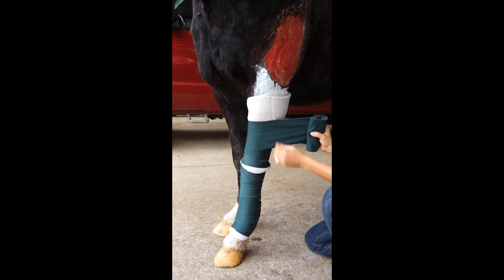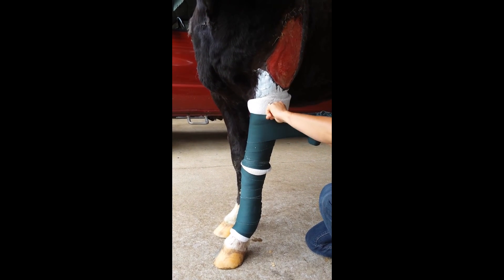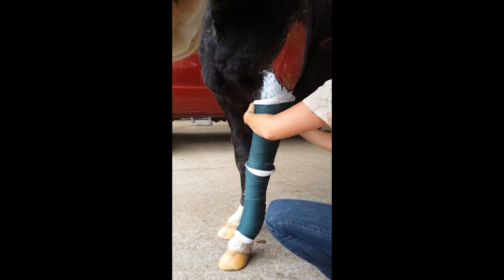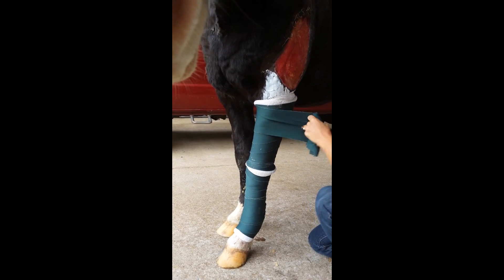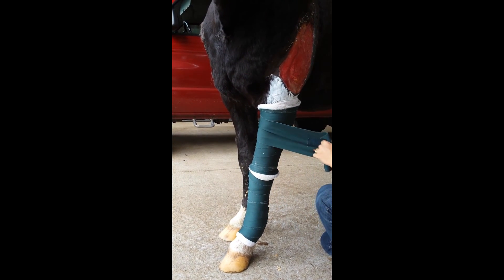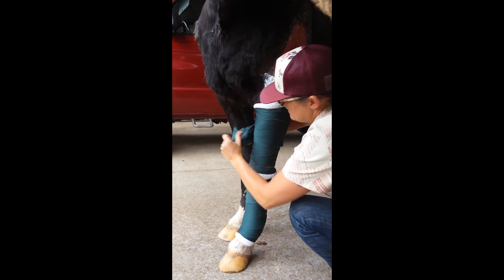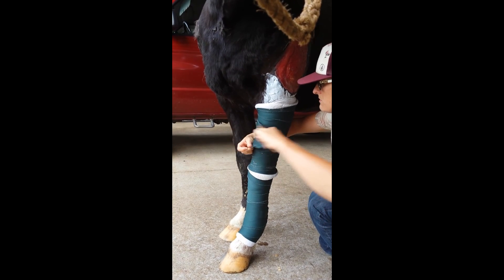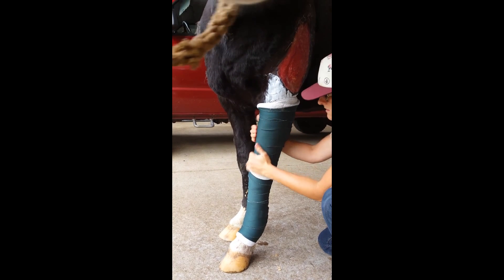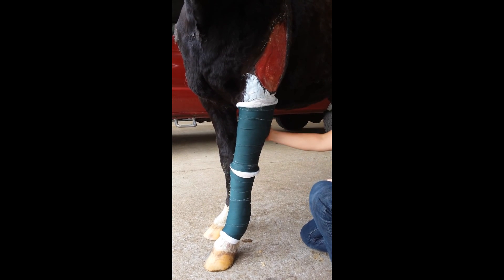I'm not pulling this tight — just taking a little bit of the stretch out. The goal should be just tight enough that it stays on and doesn't slip, but obviously not so tight that it either cuts off circulation or is uncomfortable. On the fatter parts of the leg like this, sometimes your Velcro is not quite long enough to go all the way around, but I think we'll be fine on her. So this wrap shouldn't be able to slide all the way down the leg. And then we'll address the actual wound.